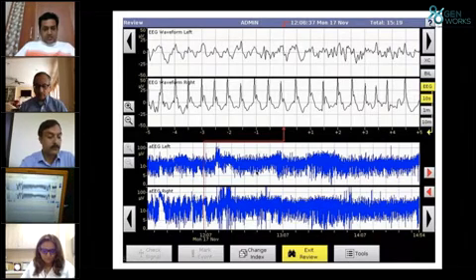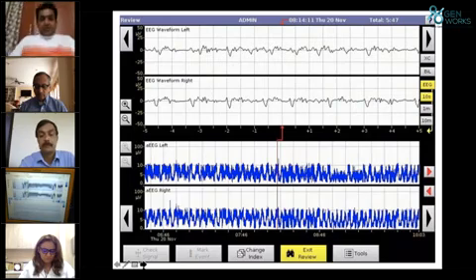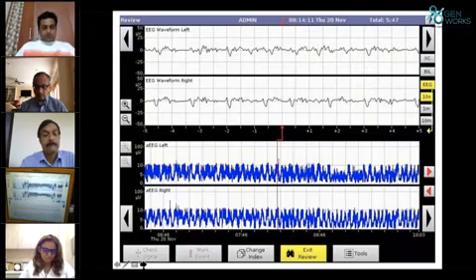Next slide, Prashant. Yeah, this we tend to confuse with status epilepticus, but this can be secondary to a false amplitude, false probe placement, or frequent handling of the unit as such, where we need to be very particular about the seizure activity. Over to you, Prashant.